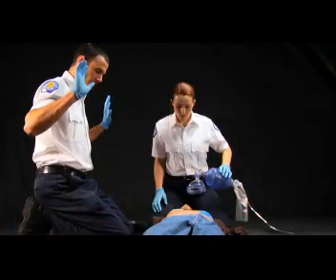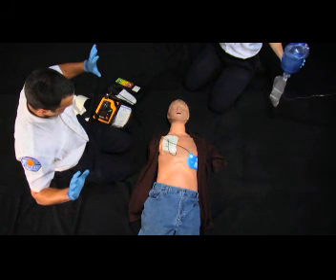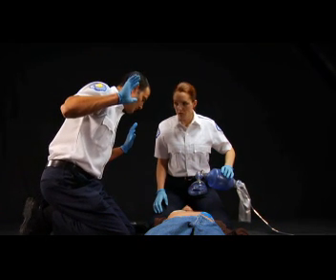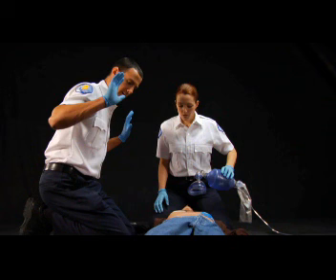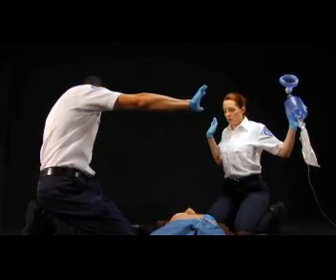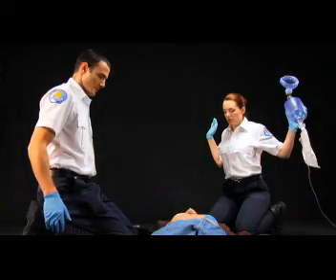After the pads are applied, you may be prompted to shock the patient. Clear the patient by making sure no one is touching the patient or their clothes. Position yourself over the victim to warn other rescuers and bystanders. Extend your arm and look to confirm you're not touching the patient. Then loudly state: I'm clear. Make sure no one else is touching the patient, and state: You're clear. Look up and down the entire patient, then state: We're all clear. Once the victim is properly cleared, press the shock button. Shock delivered — it is safe to touch the patient.